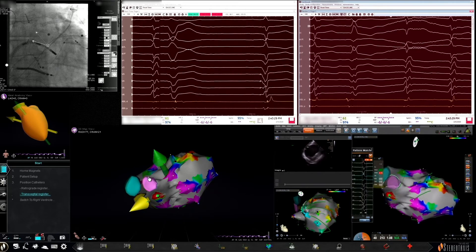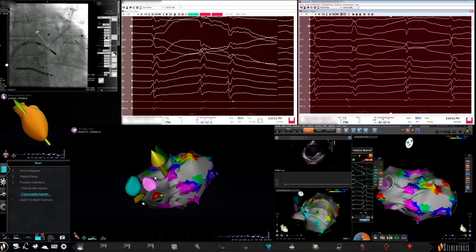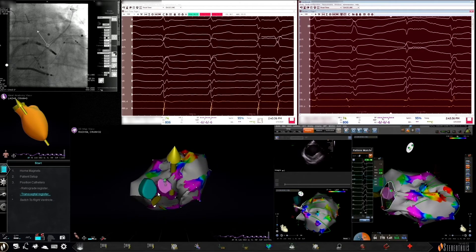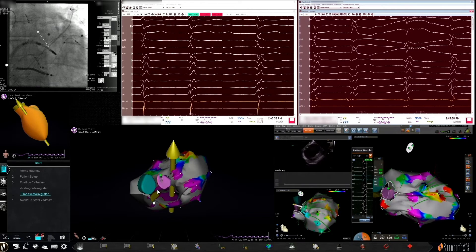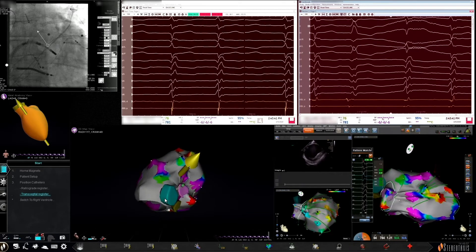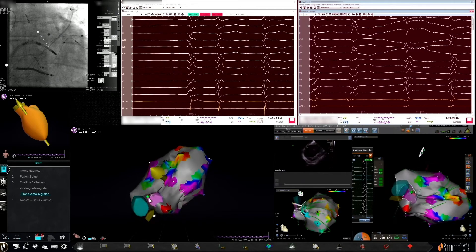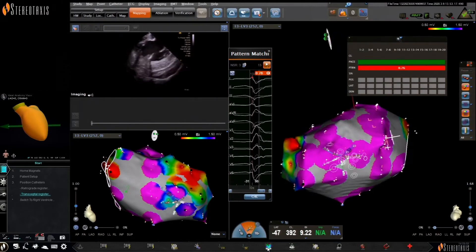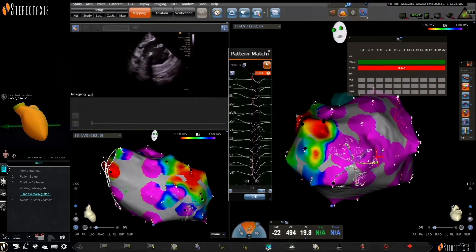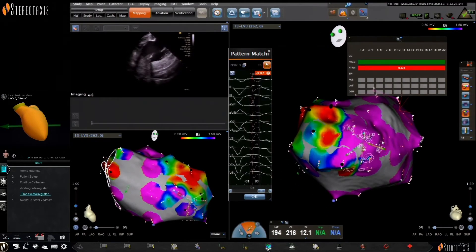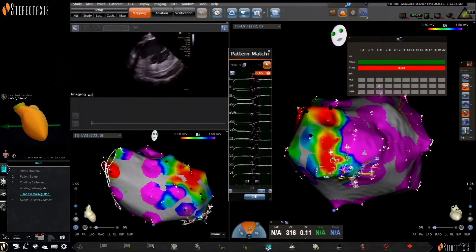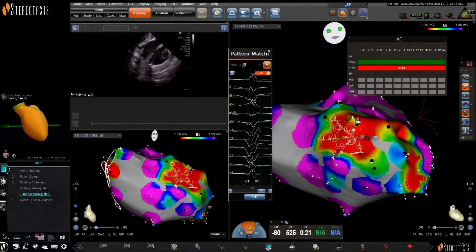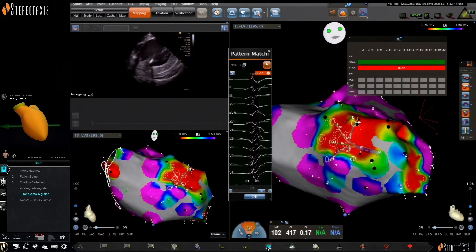Mapping underneath the cusps and the basal areas of the left ventricle — which in particular in non-ischemic cardiomyopathy is of importance — is not impeded with the use of a magnetic catheter, and in fact makes it much easier to map these sometimes difficult-to-reach areas. Now that an area of scar has been delineated in the apical and anteroseptal region of the left ventricle, the RMT catheter is replaced with a Pentaray catheter, which will allow collection of higher-fidelity data and many more points.